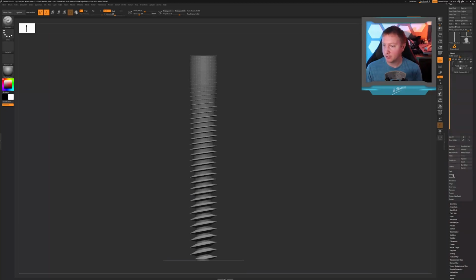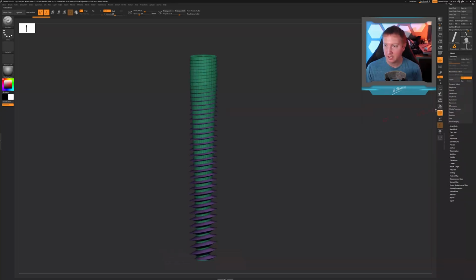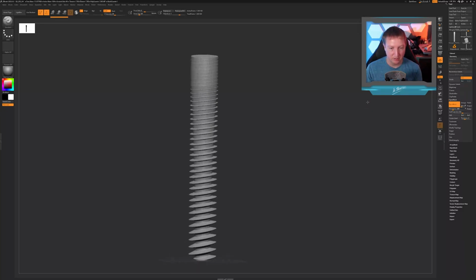So let's come down here to merge, and we will do merge visible. That will populate us up into this new tool. And now we need to merge the geometry here because it's still two separate objects, as you can see. So let me go to Dynamesh, and let me Dynamesh this, and let's just see how that looks. Let's increase our resolution of that remeshing to 200. All right, that looks pretty good.